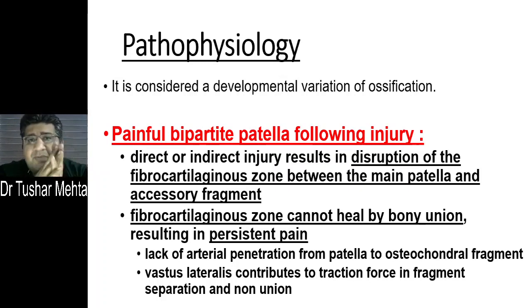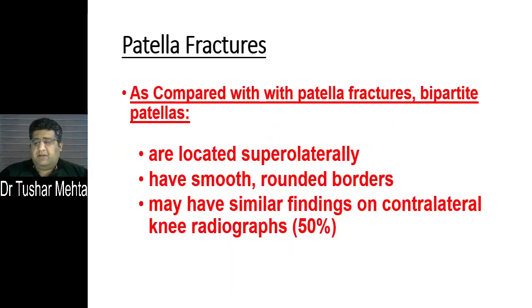I told you the hypothesis. I told you there will be disruption of the arterial channels, and even the accessory fragment might go into infarction. The second reason that I told you was that vastus lateralis will keep on pulling that accessory fragment. Are we able to connect these points now?